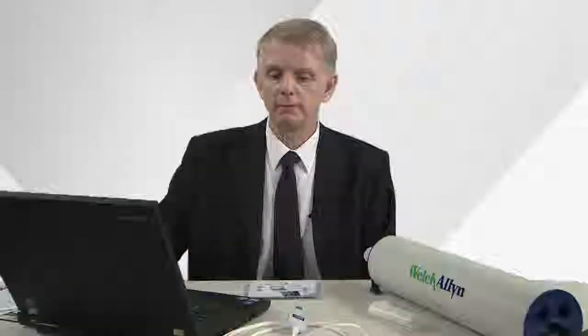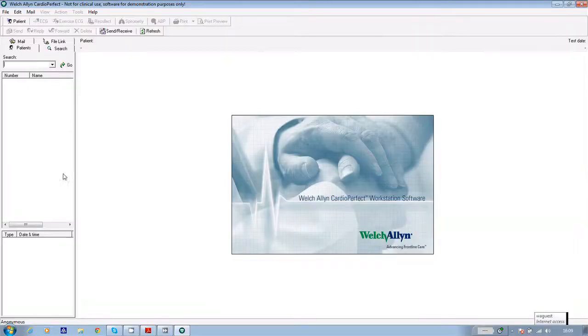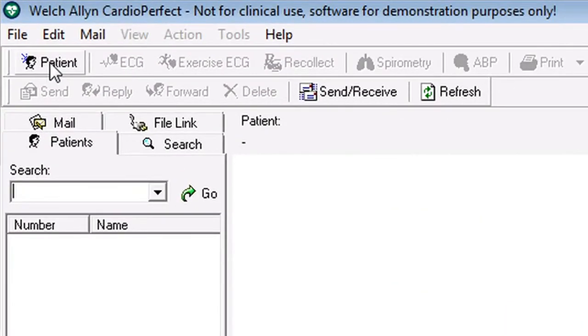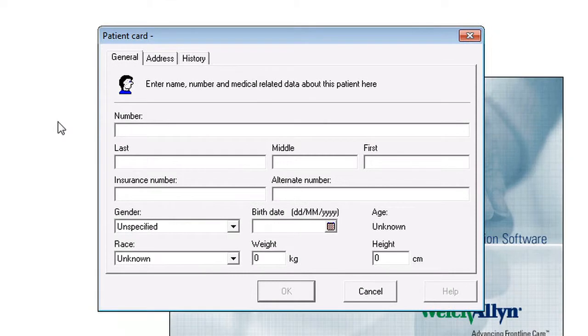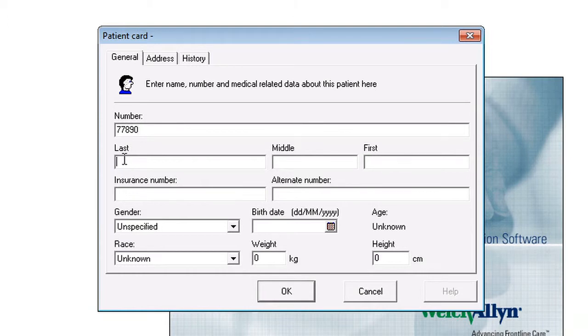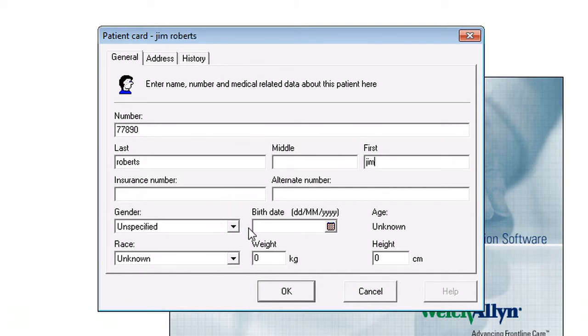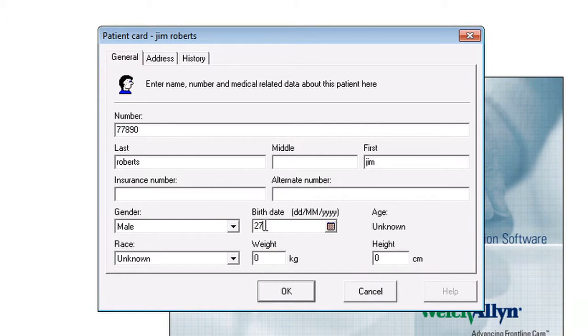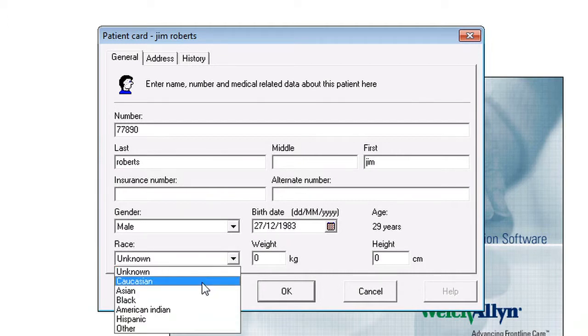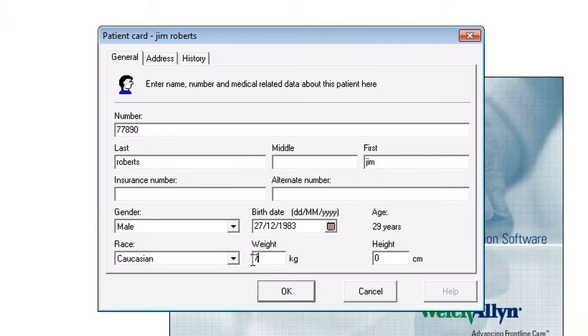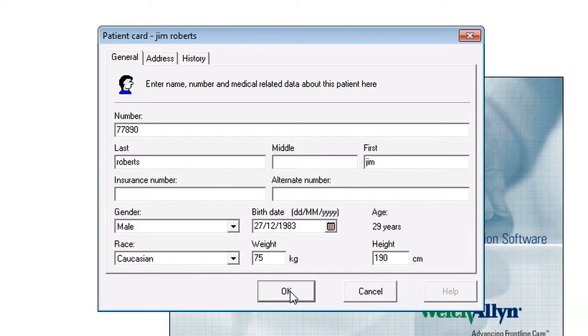Now taking a spirometer test using the CardioPerfect software is really easy. Open the software and enter the patient's details as required. Click on patient in the top left hand corner of the screen. First enter their NHS or other ID number, last name, first name, gender, date of birth, race, and weight.